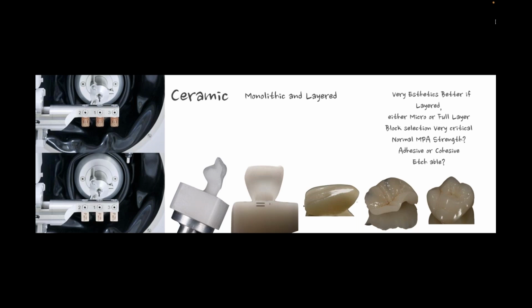I follow this formula a lot today with some of the digital materials. Now, most of you know that I'm a big fan of the Mark II. I always joke and call it Evolve, hint, hint. But I think most of you know that I like this material a lot. And when I use this material very thin, even though in the thicker version of it, it's probably more like a transparent dentin, or maybe close to a dentin opacity-wise, the thinner I make it, the more translucent it becomes.